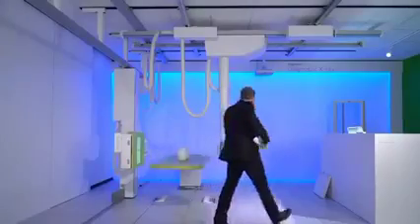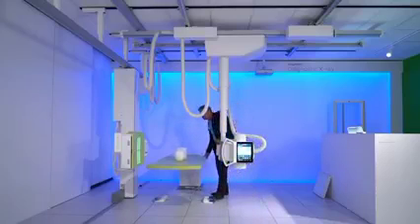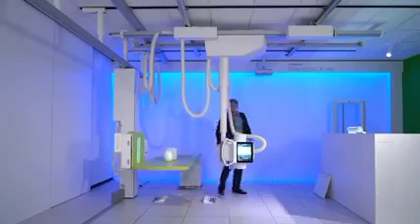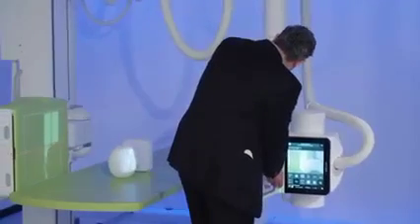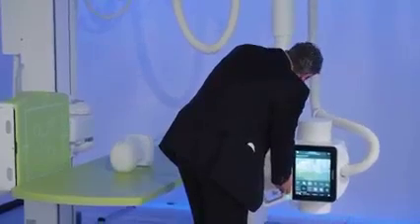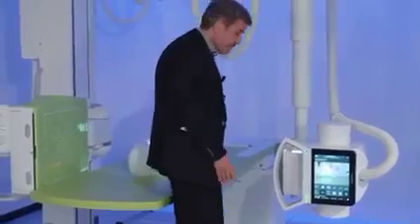For example, you have a patient on the table, difficult to move, but you can move the patient towards the detector. The patient is a little bit lower on the table, so the only thing you need to do is to focus on the patient. You position anywhere you need to be. In this case, you focus on the C-spine.